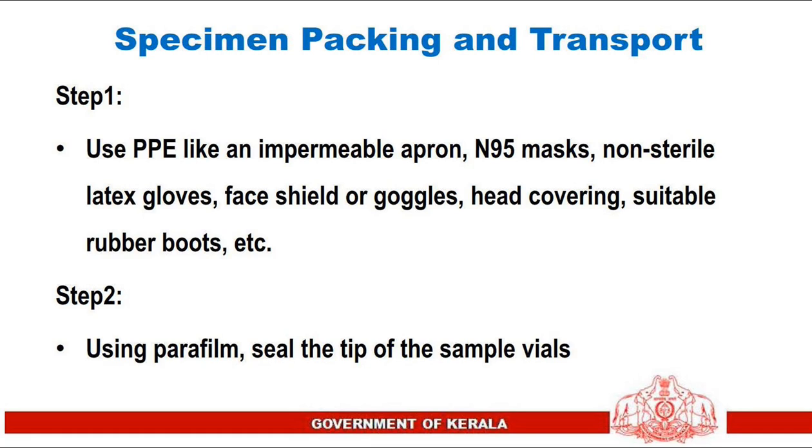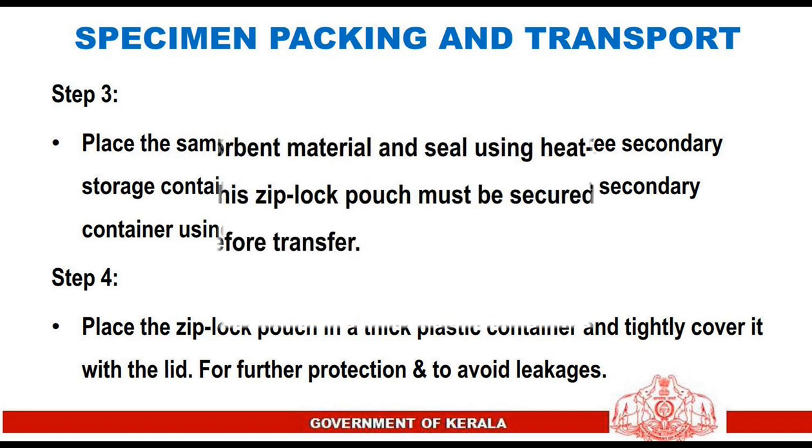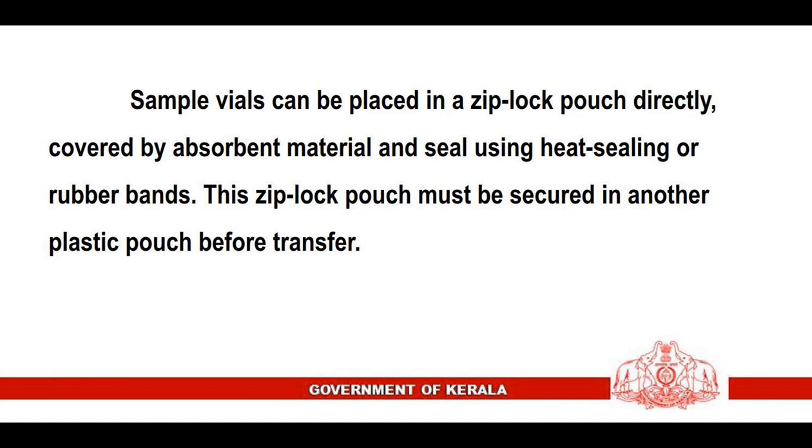Specimen packing and transport: Step 1 — use PPE including an impermeable apron, N95 mask, non-sterile latex gloves, face shield or goggles, head covering, and suitable rubber boots. Step 2 — seal the tip of sample vials using parafilm. Step 3 — place sample vials in a leak-free secondary storage container like a centrifuge tube and secure in a ziplock pouch. Step 4 — place the ziplock pouch in a thick plastic container and tightly cover with a lid. Alternatively, place vials in a ziplock pouch covered by absorbent material, sealed and secured in another plastic pouch before transfer.